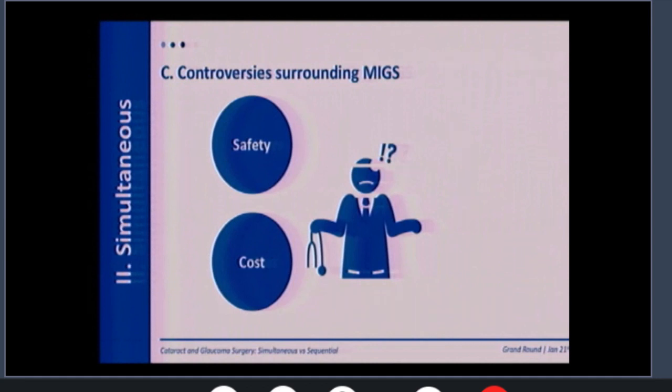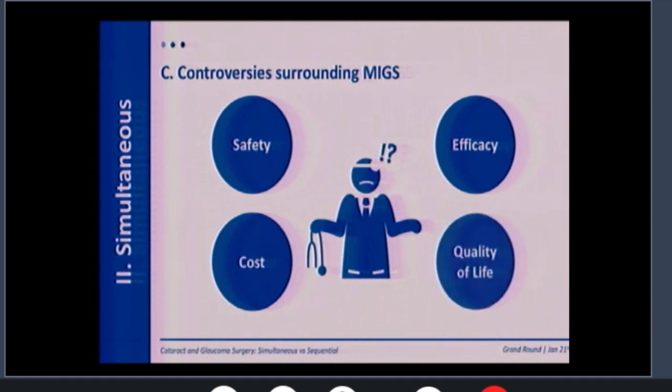So this is dependent on the geographic location. Efficacy: the eye stent is probably supported by a lot of trials that support its efficacy in the long run, but the other newer modalities of treatment are still awaiting long-term follow-up. Some people are still skeptical that the long-term outcome of MIGS is not as you wish it would be.